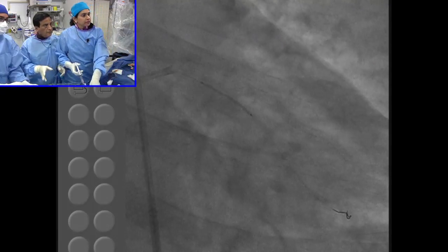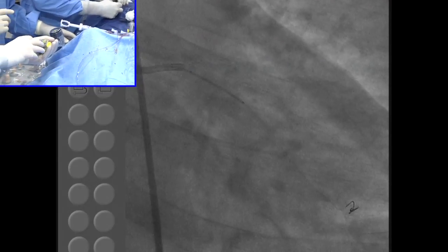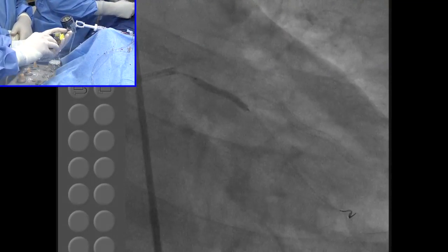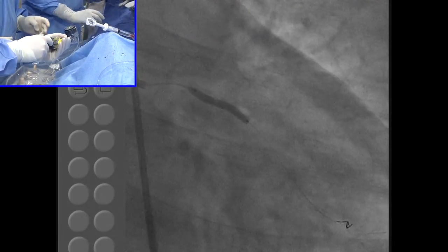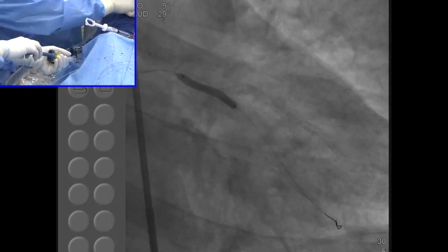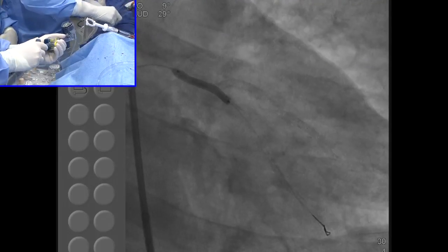Good. Go up. No, just go up. Yeah. Take it. Yeah, that's what I was thinking. Okay, go. You'll need to come back. Yep. This is the 2.75/20 for the main. Yeah. Go, 14. 16 or 20 millimeter? This was 20. Okay. Down. No, take out the whole thing. Wire will be okay. Yeah, go up again. Do a little distal massage in this one.